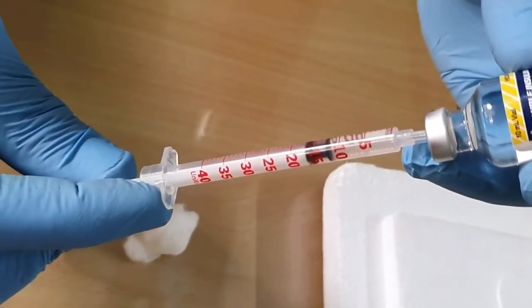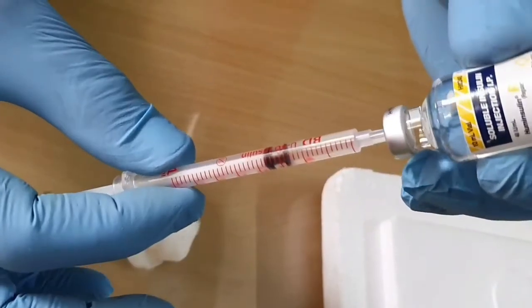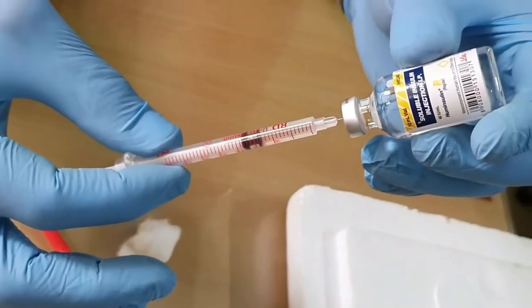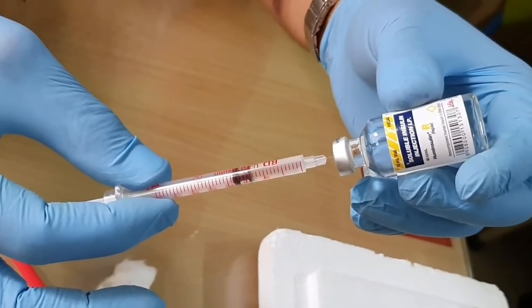The only thing is that you have to withdraw it slowly so that only the insulin is there inside. Now remove it, and while pulling out, pull it out straight. Otherwise, there are chances of the needle bending.